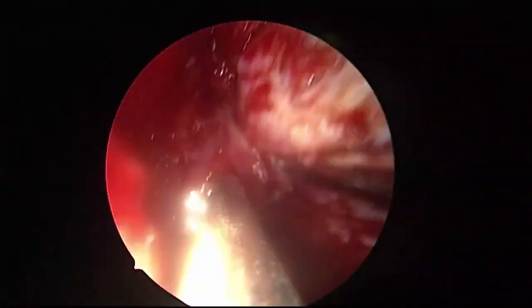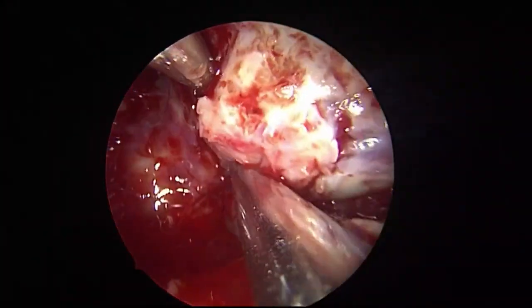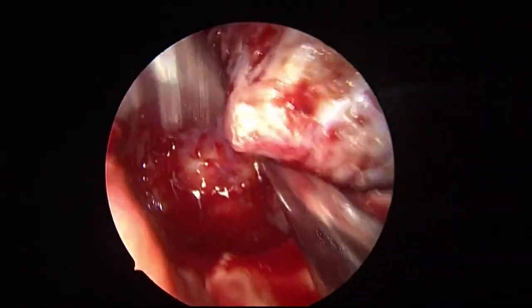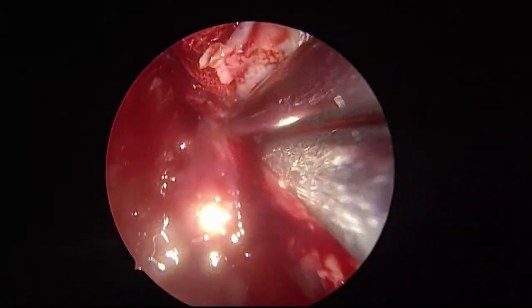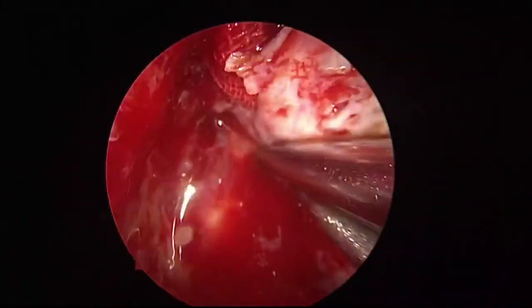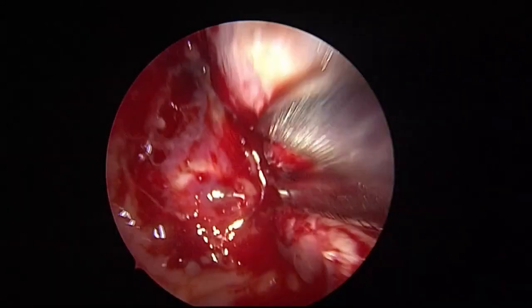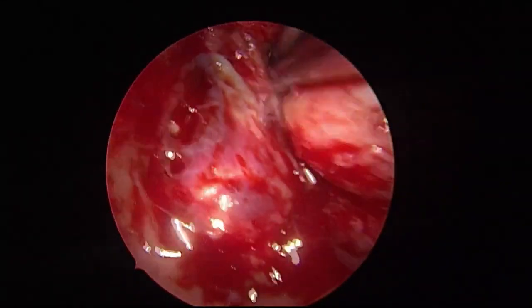All the time we have to keep pushing it medially to expose the posterior wall. See, I am flushing the medial wall till the posterior wall. See there? This is the posterior wall of the maxilla. This is the medial wall removed till behind. See this? Posterior wall looks thinned out.